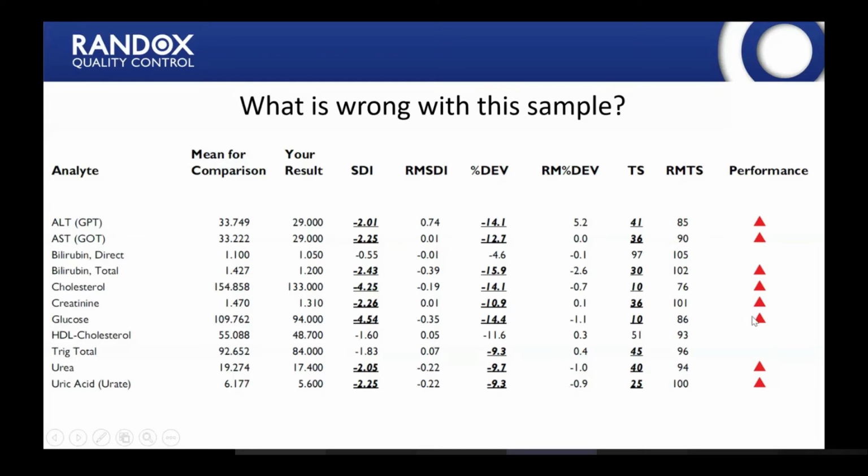So it's not necessarily a performance issue. Usually if it's a performance issue, it'll be some specific analytes, but when all the analytes are flagged as they are in this instance, then we can sort of go, okay, something went wrong with the sample and we need to look and see what it might be. In this instance, the target score is not going to help us. So we want to look at our percentage deviation, and here you can see that the percentage deviations for each of the different analytes is fairly similar, -9, -9, -11. So in this instance, we can ascertain that this has been a reconstitution error.